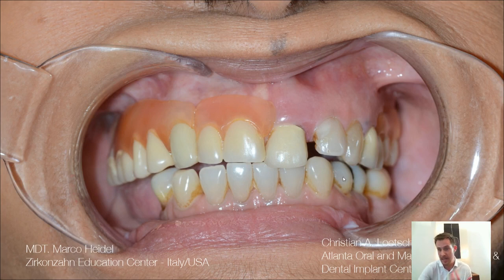It makes it a little bit difficult. But in the end, just to let you know, all the teeth in the upper jaw will be extracted. But for me it was really necessary, because we use this kind of double milling workflow as well here, that I checked the aesthetic and the function beforehand.